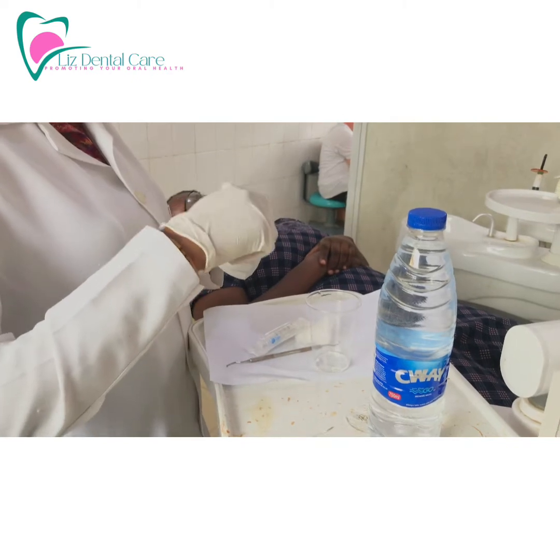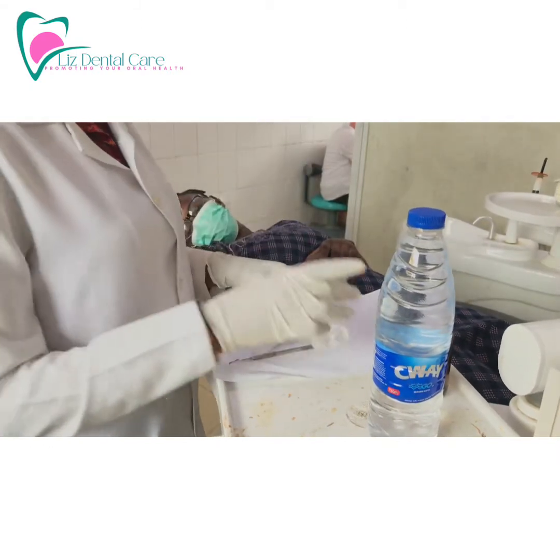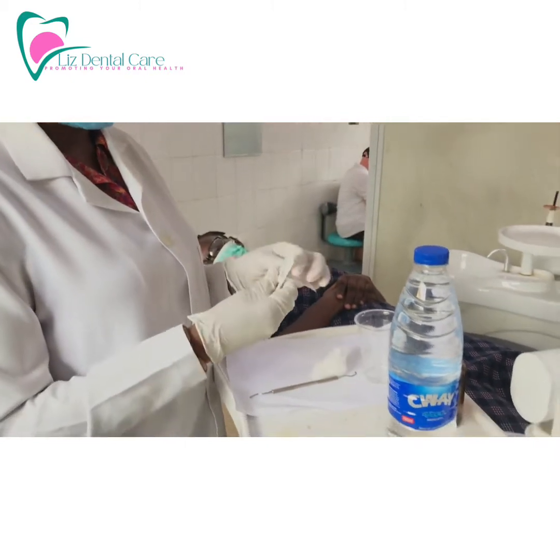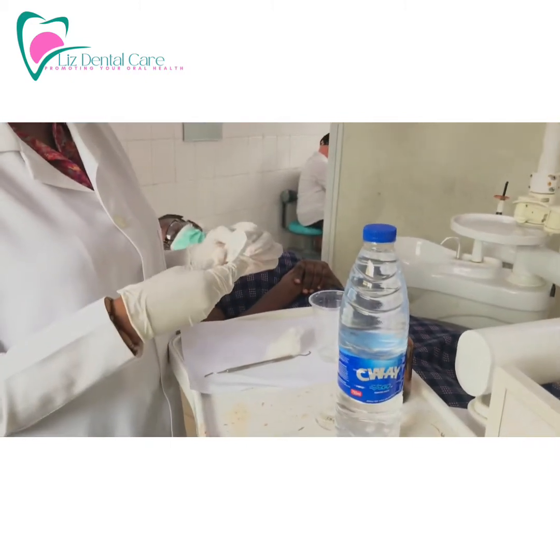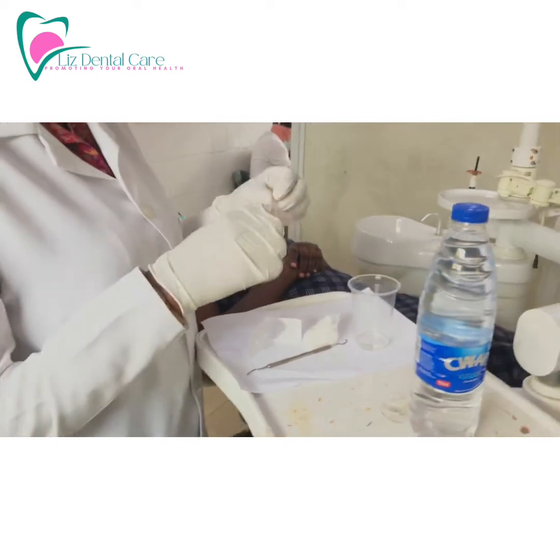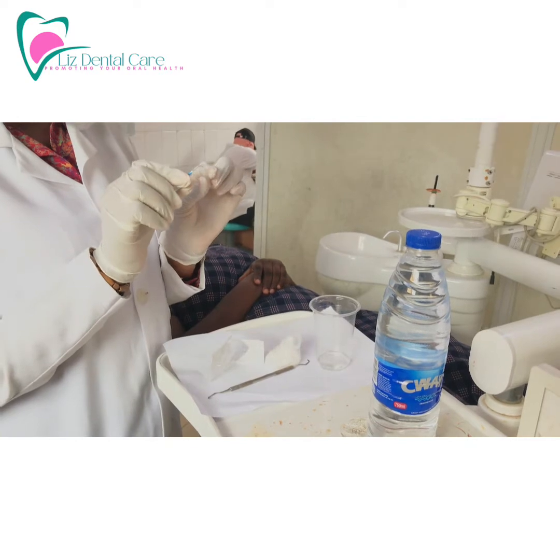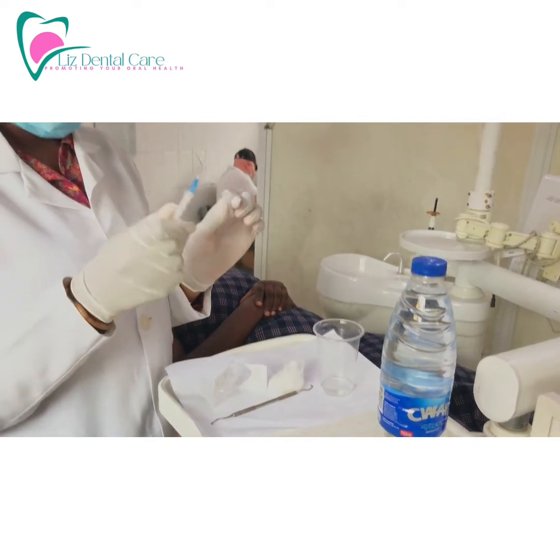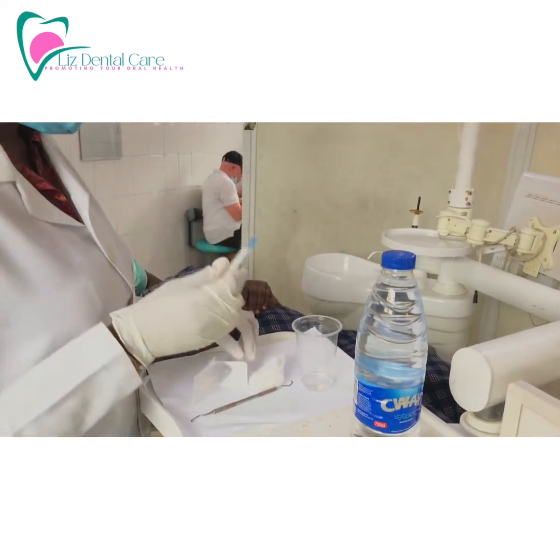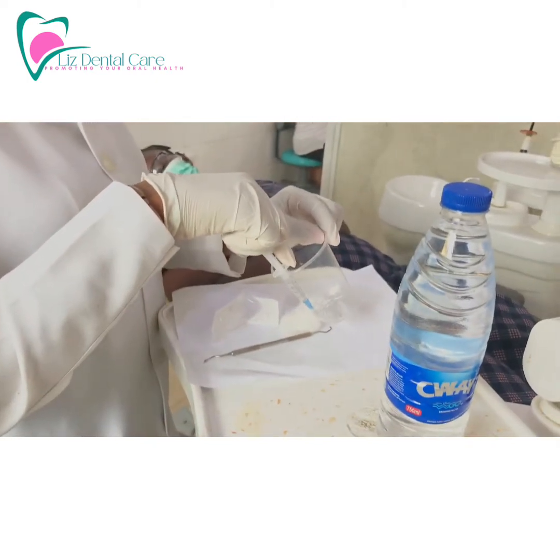After mixing the solution, the next step is to get your syringe and needle ready. You don't use the needle straight when doing a deep curettage — you bend the needle. Be careful so you don't get a needle prick. Bend the needle gently using the needle cap, and after that you can use it to draw up the solution.